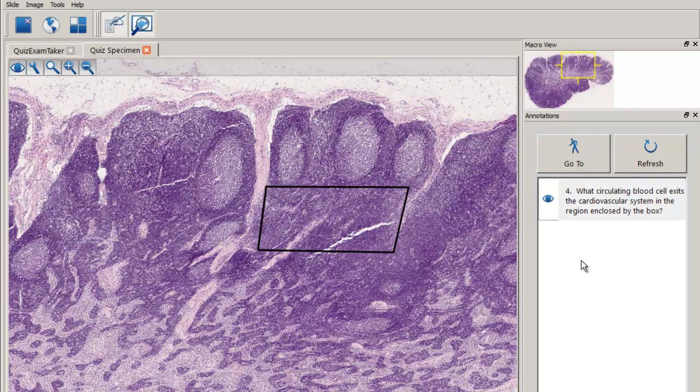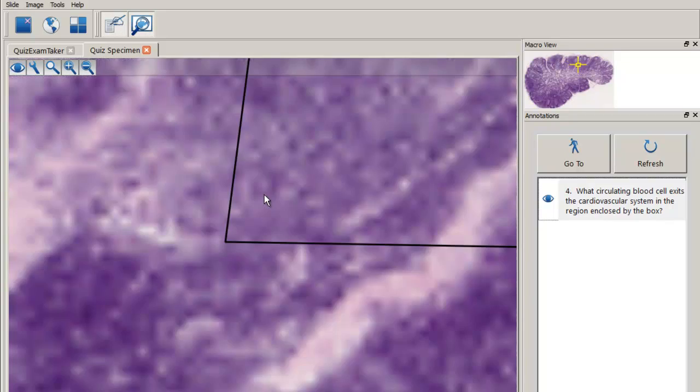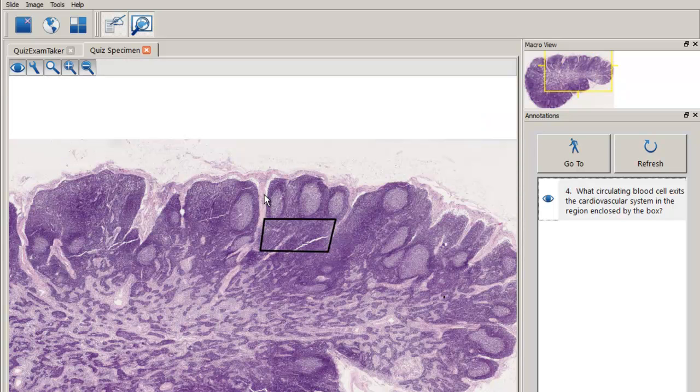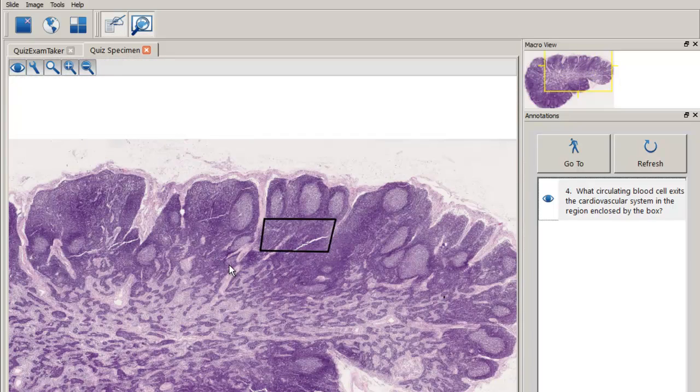Now the other way to zoom is on the PC. You can put Control plus. You see, that's what I'm doing. Keystroke, Control plus or Control minus. Control minus. And you can zoom that way. And on the Macintosh, it's Command plus, Command minus. And now, let's see, what else here?